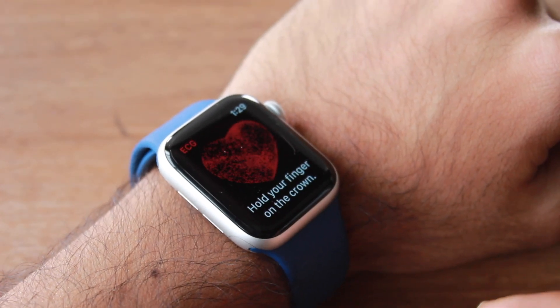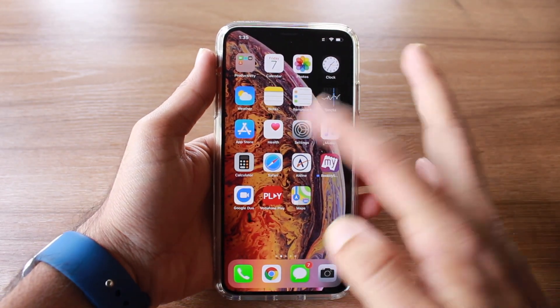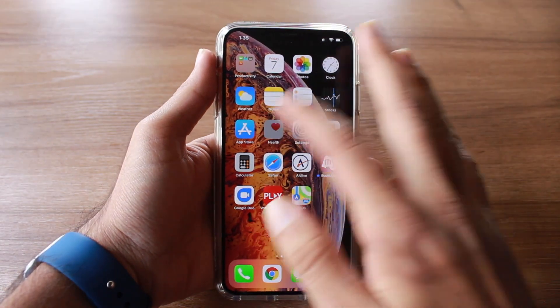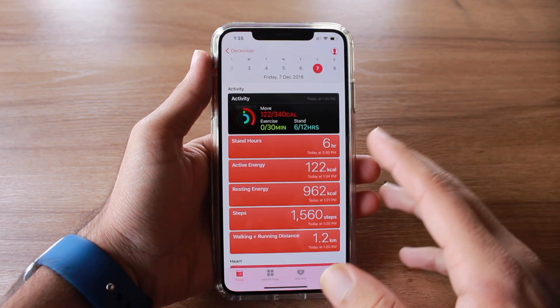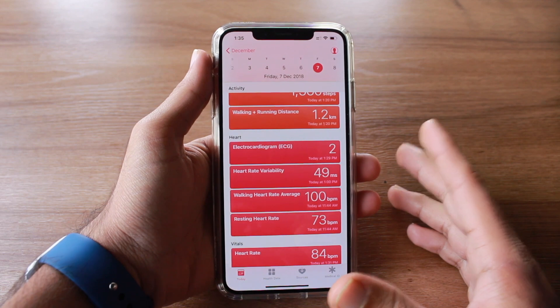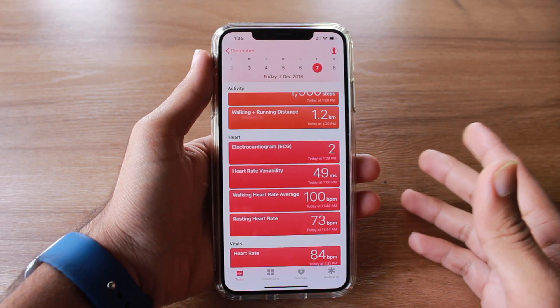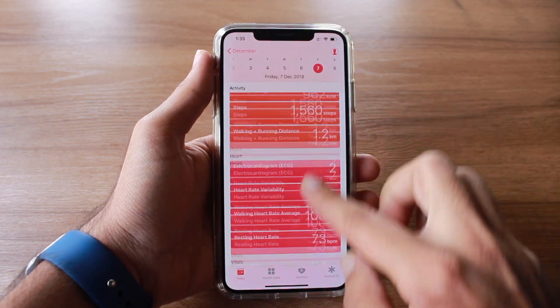Now let's go to the Health application on the phone where the ECG data is stored. Once you open the application, you get a setup menu where you just need to enter your date of birth — you need to be a minimum of 22 years old. After setting that up, you get to see the ECG data.